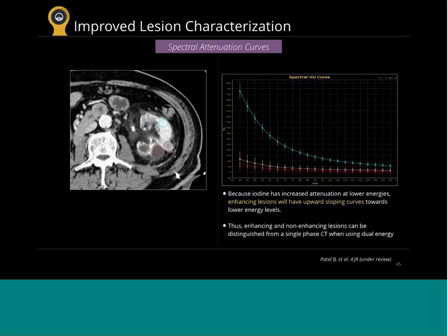All right, and this is just another way of explaining the iodine images that you're seeing. This is what the iodine image does. In the background it looks at all the voxels and says, how do the curves look? If the curves look like iodine, I'm going to make it bright or give it a color. If the curves look like water, I'm not going to give it a color or I'll make it dark. That's it. This curve in action is what you're seeing on the iodine images.